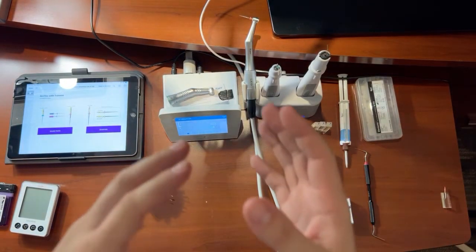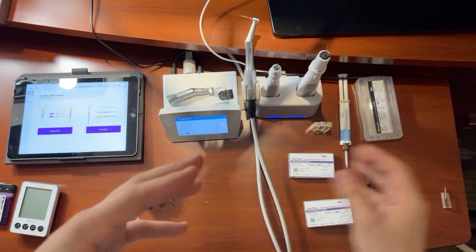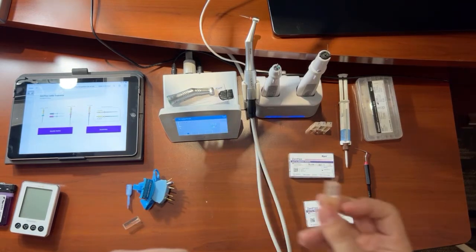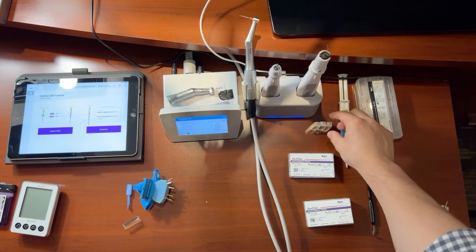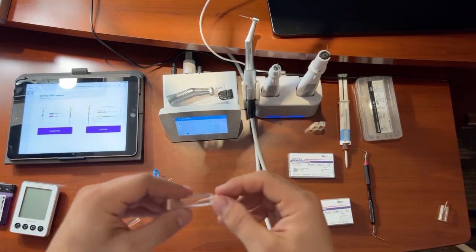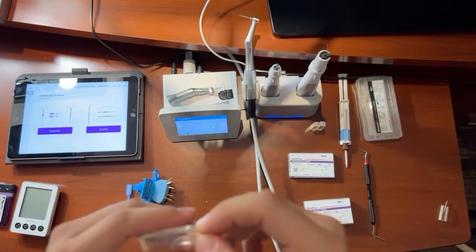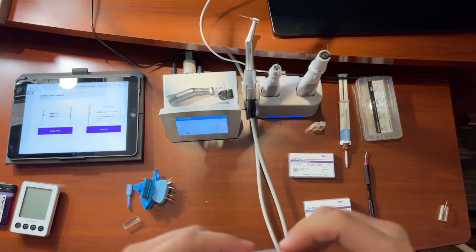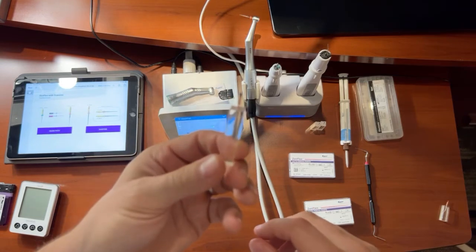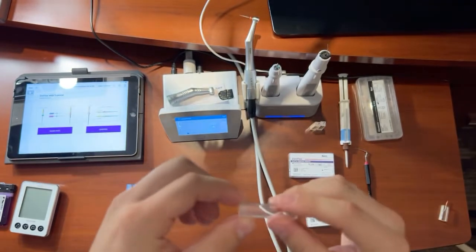So after you have shaped, you irrigate, you dry it with paper points, you're going to get your master cone and fit that in there just like so. And you want to ensure good tug back. So I have some pre-ready made ones. You want to ensure good tug back. So I'm holding this right now and it's not falling out. Just so when you do the down pack step, you don't pull the whole gutta percha cone out. You want to create an apical plug here at the bottom. And I'm going to now show you those steps.